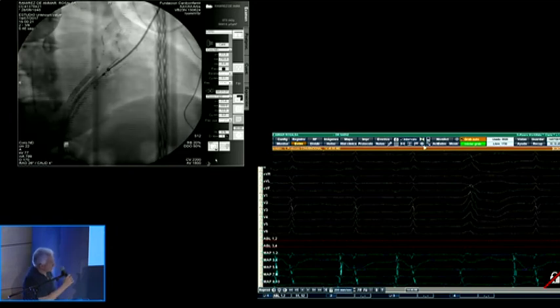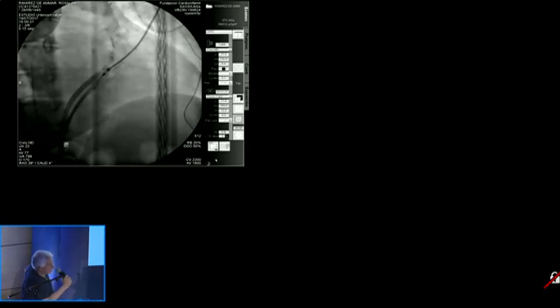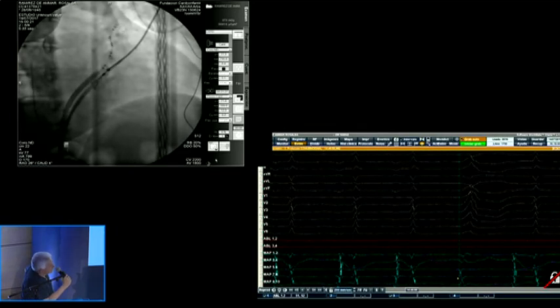You can see it, it's bracketed, and the earliest activation is in the 7/8 lead, which is perhaps somewhat early at around 20 milliseconds. So if I were to say it in a way, it's something on the LV ostium superiorly, but very, very basal, of course.